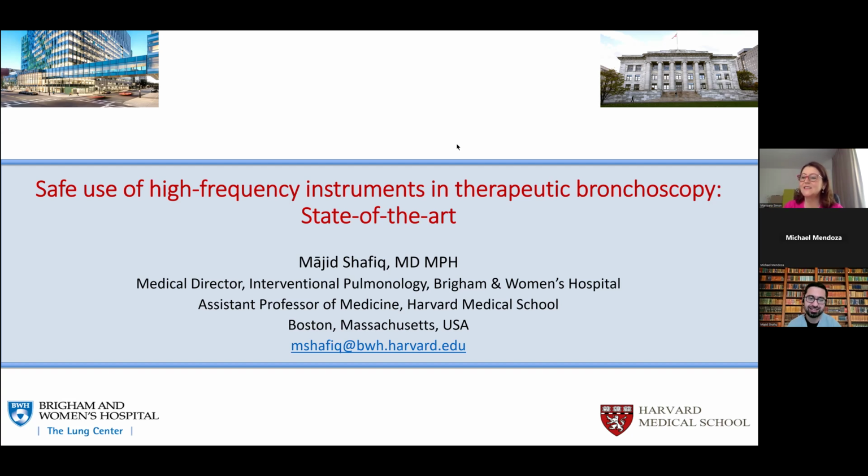Indeed, there is no general recipe for therapeutic bronchoscopy, and choosing the endoscopic technique that will be used depends on the patient characteristics, the expertise of the team, and the available techniques. And I think the best therapeutic approach is a combination of the treatment modalities and should be personalized for each patient.